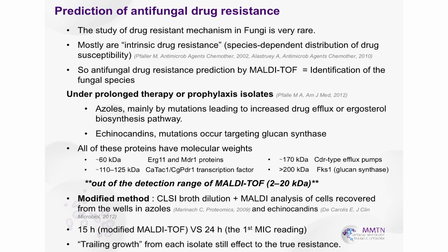And this is another limitation, the detection range: MALDI-TOF can detect only 2 to 20K Dalton. If you do something beyond 2 to 20K Dalton, is it worth it? Question mark. Today there are so many question marks. So they try to do modified methods here, still in process.